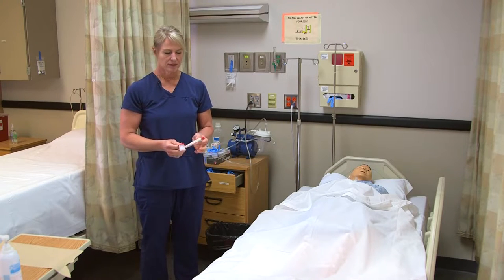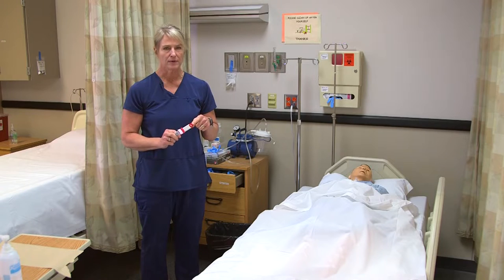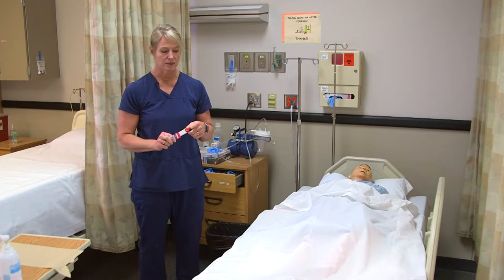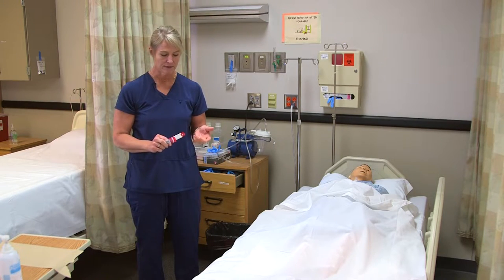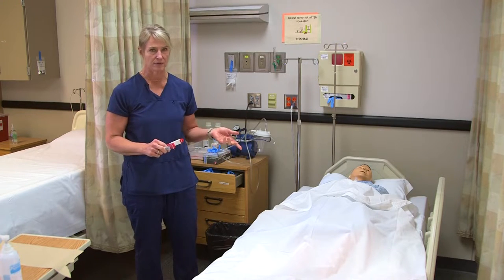To take a rectal temperature, the only supply we need is a rectal thermometer. The rectal thermometer will always be red, so you should only use that for this route — do not use it for an oral temperature, and don't use a blue or oral thermometer for the rectal route.